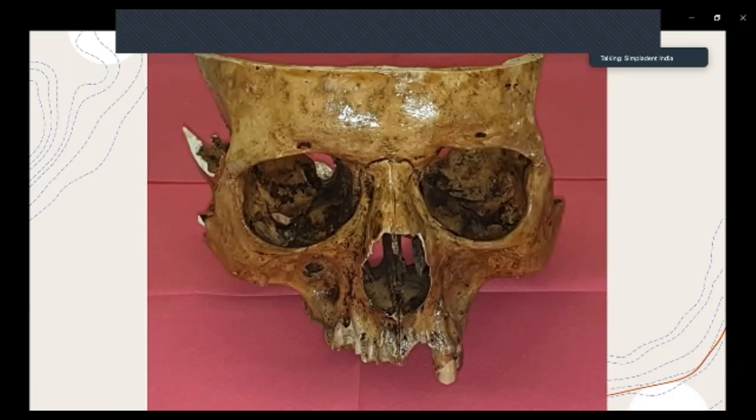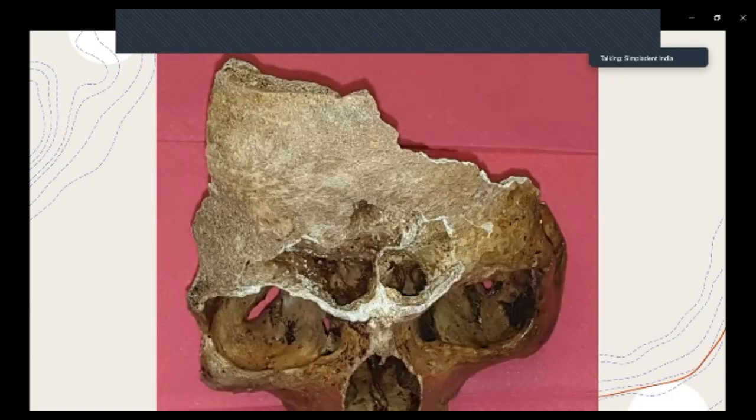So there are some pictures you can see. This is a picture at the cranial view. You can see the frontal sinus. Anterior to the frontal sinus, you can see a much more mineralized structure, much more bone is there. So that is the area you can go, superior to the frontal sinus, you can engage the bone also.